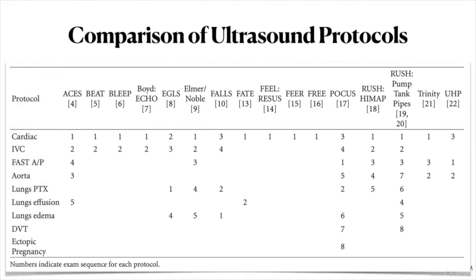As you can see here, RUSH has one of the most extensive assessments involving 8 steps compared to other protocols. However, as you do point-of-care ultrasound every day, regularly, you will develop your own steps and you will adjust them with different clinical settings accordingly.